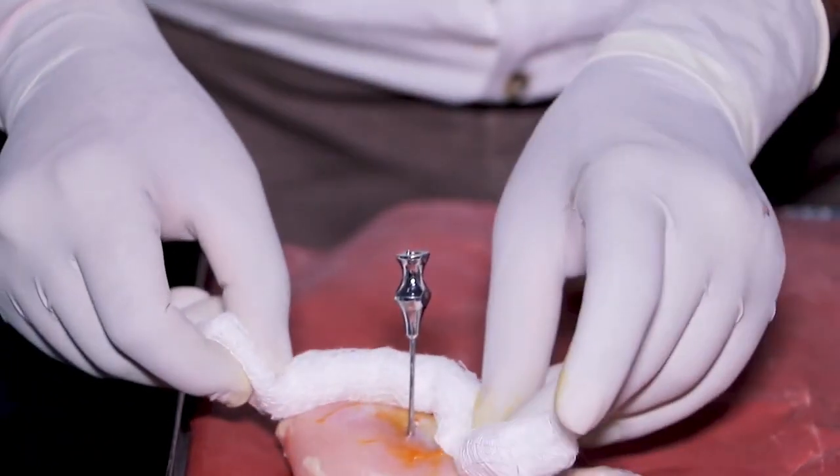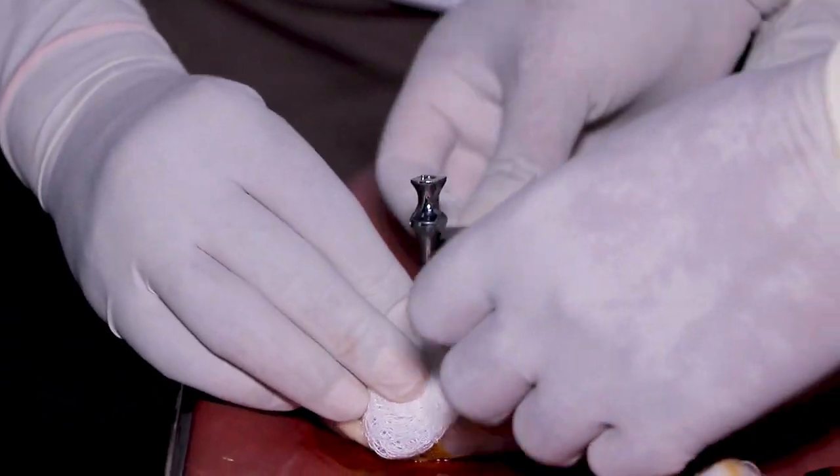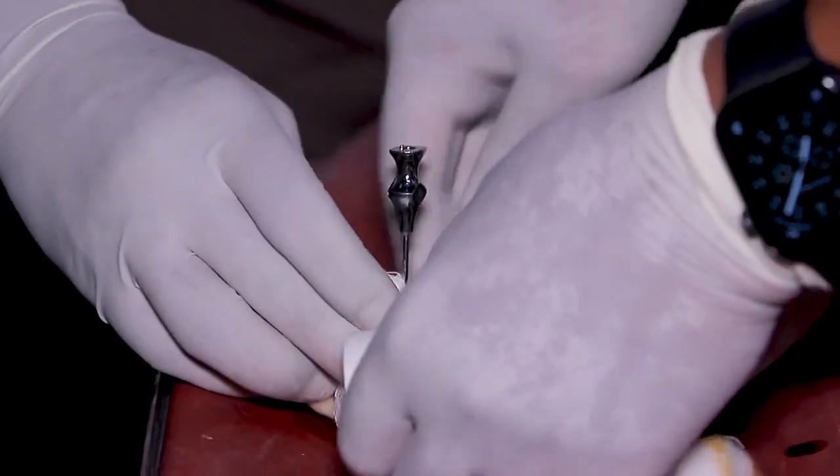Secure the IO needle with gauze and dressing tape. Check the site hourly for leg swelling and signs of extravasation. The most common complication is extravasation of fluid due to penetration of the bone or incomplete insertion.